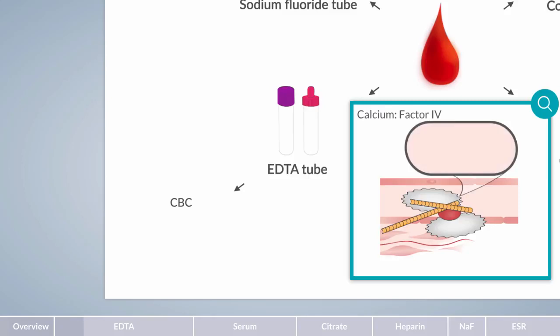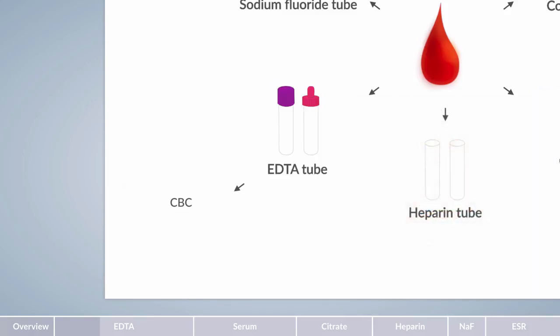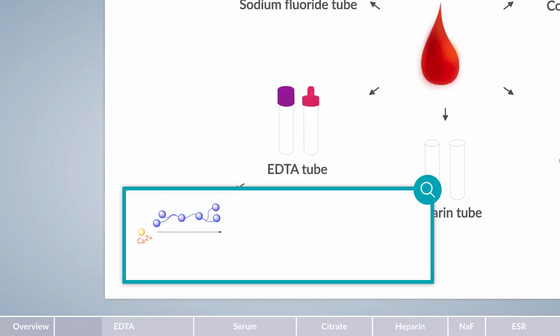So let's look into this in more detail. Calcium mediates the binding of coagulation factors to negatively charged surfaces such as the cell surface, thereby facilitating blood clotting. You can find out more in Part 3 of our series of Chalk Talk episodes on secondary hemostasis. Let's take a look at what EDTA does. To ensure that there's no calcium in the blood sample, a molecule that has a high binding affinity to calcium is required, EDTA. The EDTA molecule and calcium form a complex, which results in calcium unable to initiate coagulation.